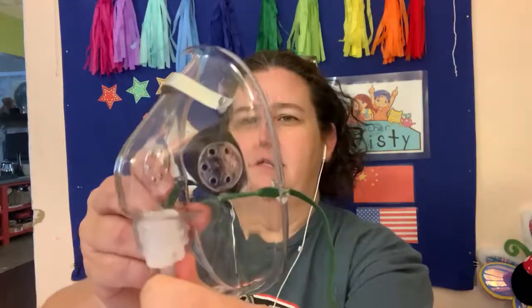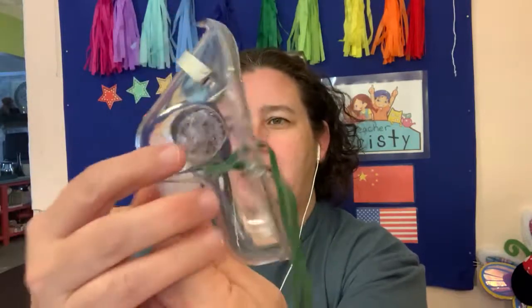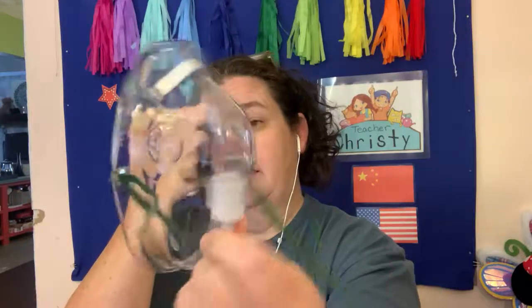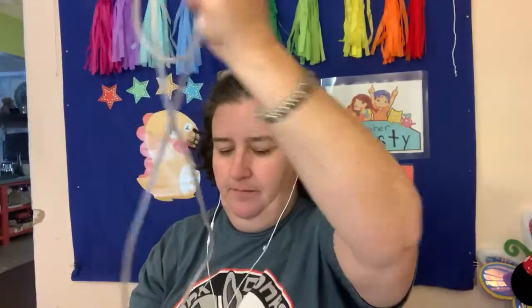The simple mask goes over your nose and mouth. It has small ports on the sides — little holes you can't put your finger through. It is the step up from a nasal cannula. It has a metal band you can tighten around the nose so oxygen doesn't blow into the eyeballs, and an elastic band to tighten it. You attach the tubing to the flow meter on the wall, attach the mask, and turn it up to at least five liters.